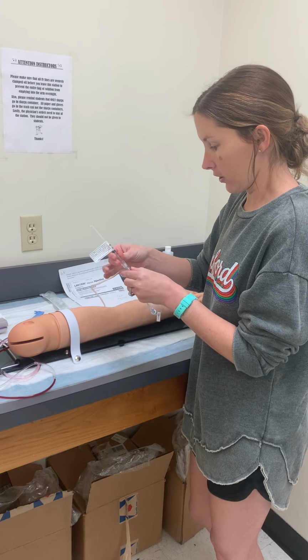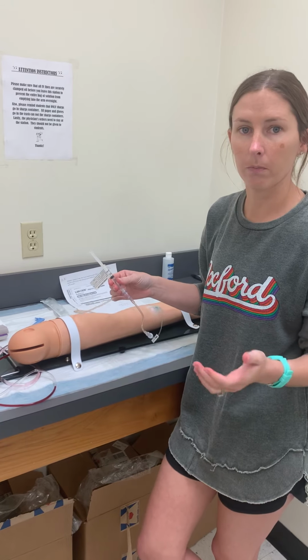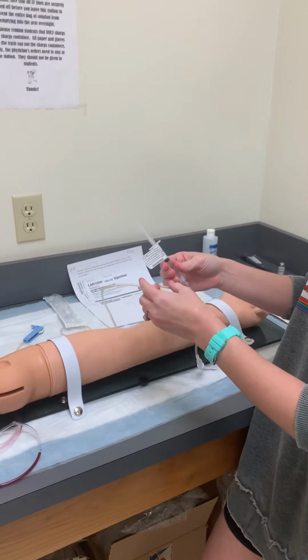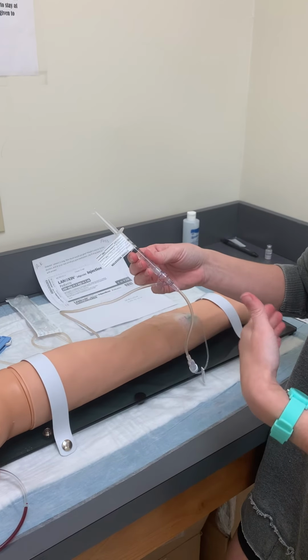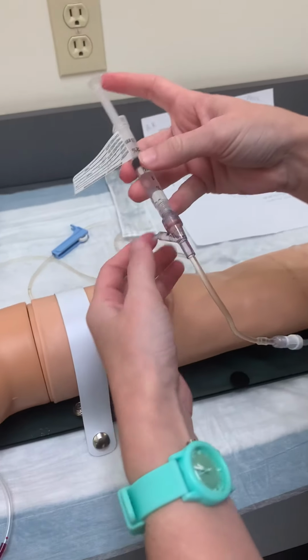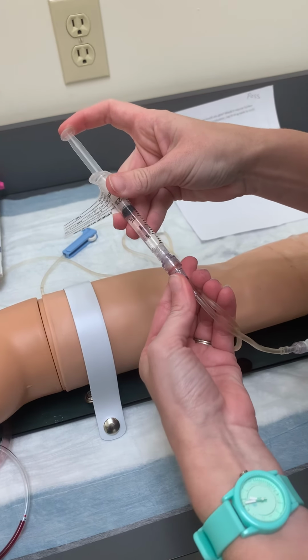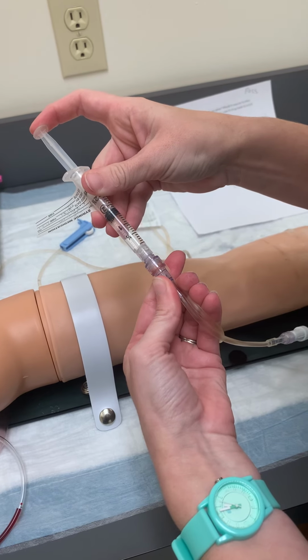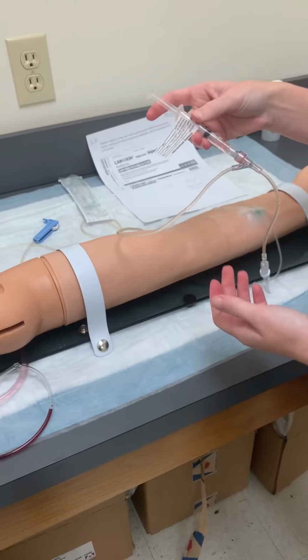I'm going to be giving these 2 mLs over 5 minutes, so that is 0.4 mLs per minute. While I'm administering the medicine, I'm going to clamp off behind, and then whenever I stop, I will open it up and let it flush through. Okay. So I'm going to start on 12, which is now. I'm going to administer 1, 2, 3, and 4. Okay, then I'll let it open up and flush the medication.